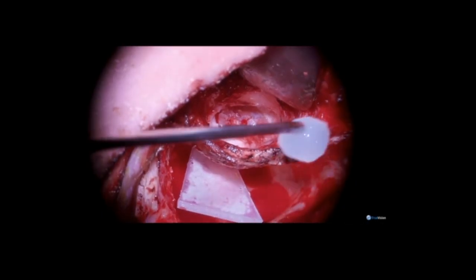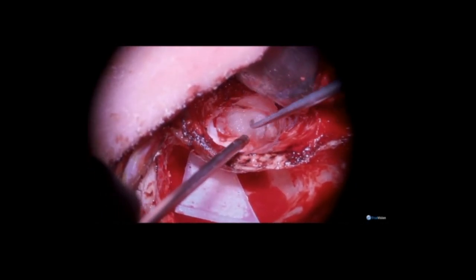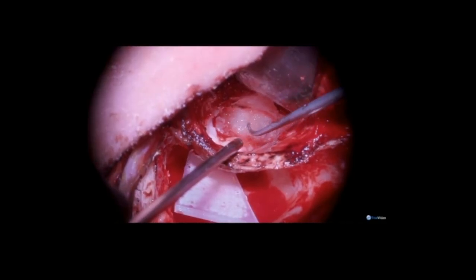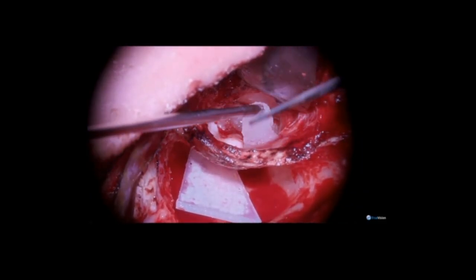I have also rotated the flap that we created earlier over the cartilage graft, and I'm now packing the external auditory canal with absorbable material to hold things in proper position.